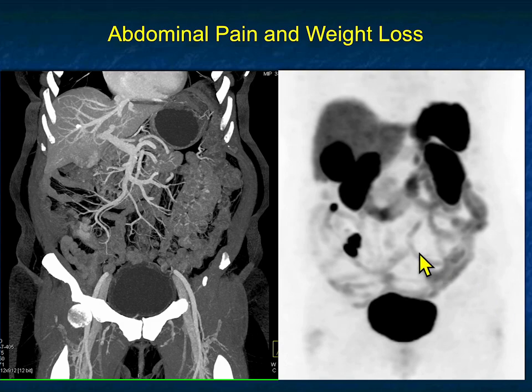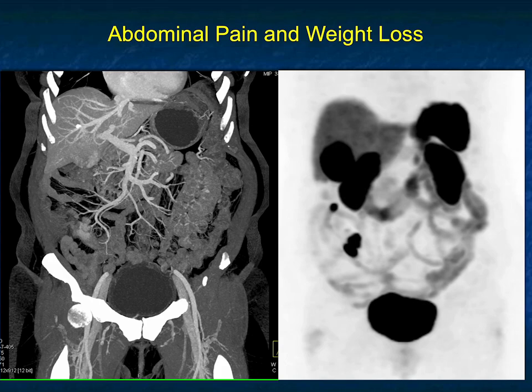There's also an additional small bowel lesion. A vascular mass in the liver with an enhancing mass in the right lower quadrant, in the small bowel, maybe a bit in the mesentery. What's this going to be?